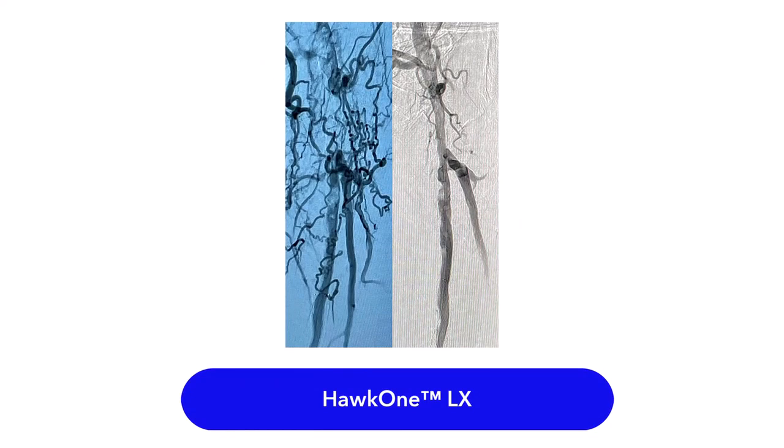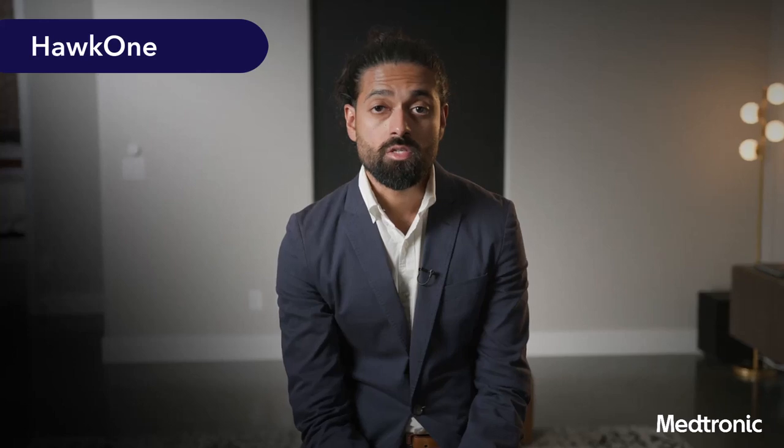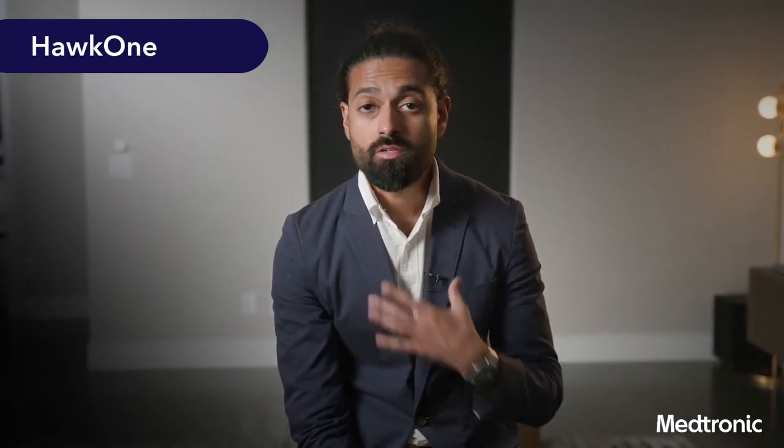The patient was able to avoid a bypass, and symptoms were relieved as well. So I think it's a perfect example of how atherectomy can be used even in areas where I initially didn't feel comfortable with, but over time I was.